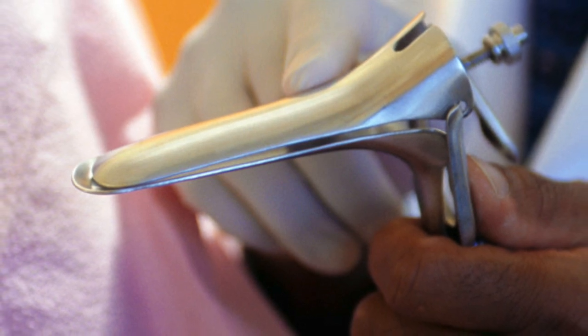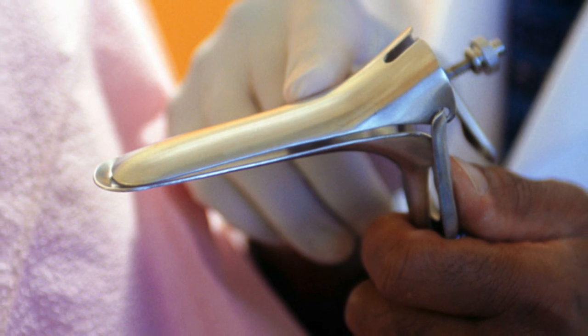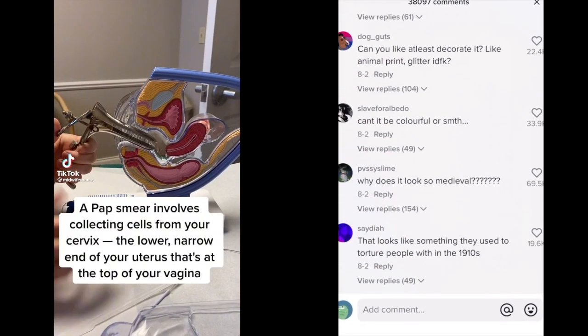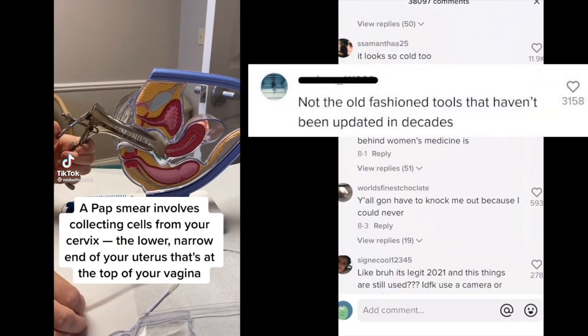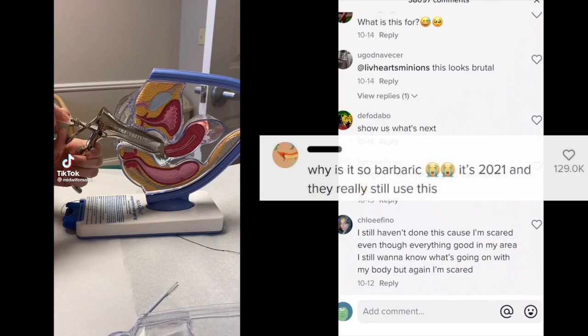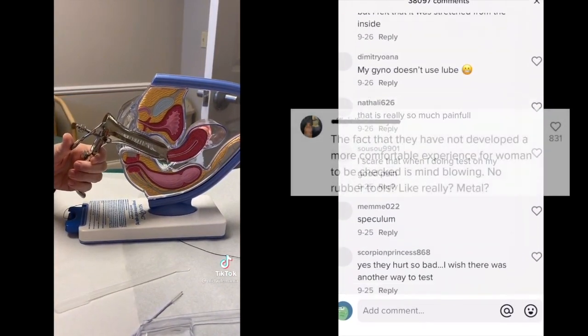This is a vaginal speculum used in routine pelvic exams and pap smears. If you've ever used this and disliked the experience, you are not alone. This video shows what a typical pap smear looks like. As you can see from the comments on the screen, there are a lot of concerns from women who undergo these procedures regularly. There are even several pleas for a complete redesign of the instrument.